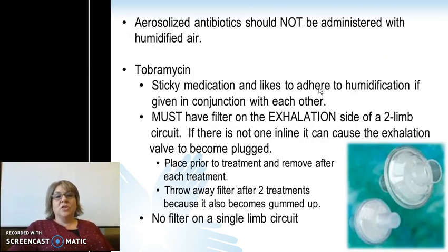Aerosolized antibiotics should not be administered with humidified air. Tobramycin is an example of this. Toby is a very sticky medication and likes to adhere to humidification if given in conjunction with each other.